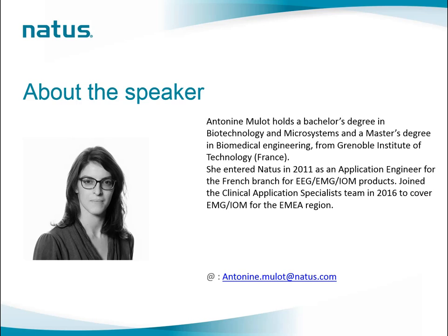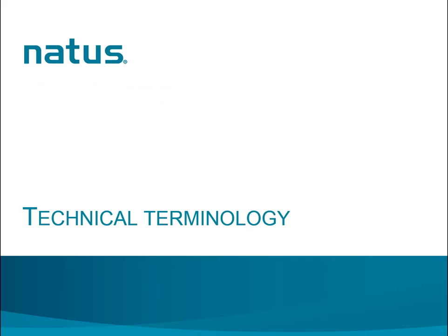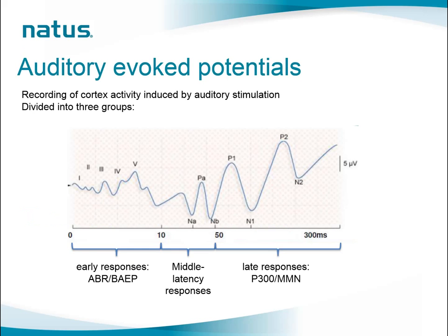So let's go to the AEPs. When we discuss AEPs, I want first of all to give you a few definitions or terminology that we are using for those specific protocols. First of all, what is an auditory evoked potential? The auditory evoked potential is the recording of cortex activity induced by an auditory stimulation.